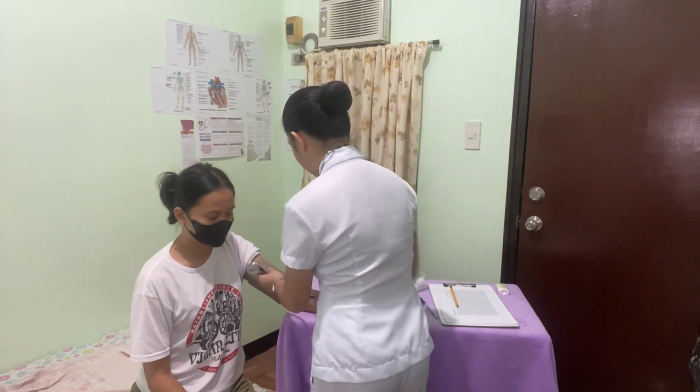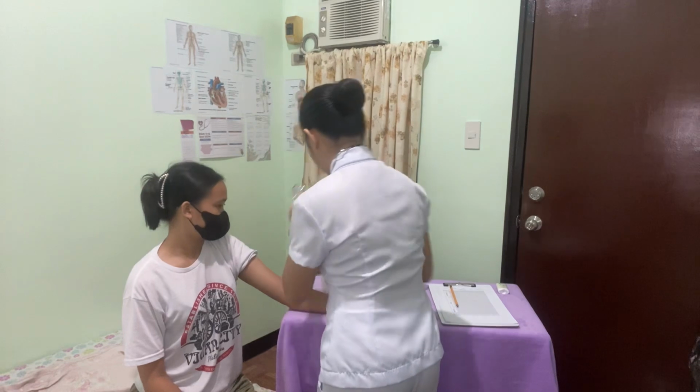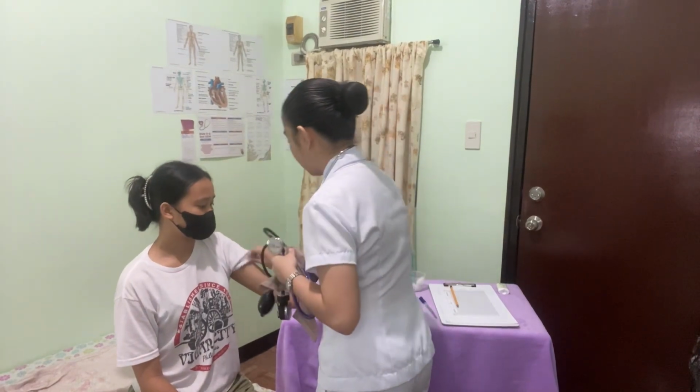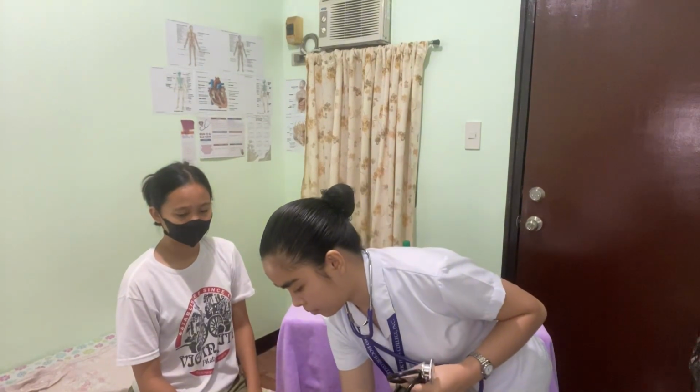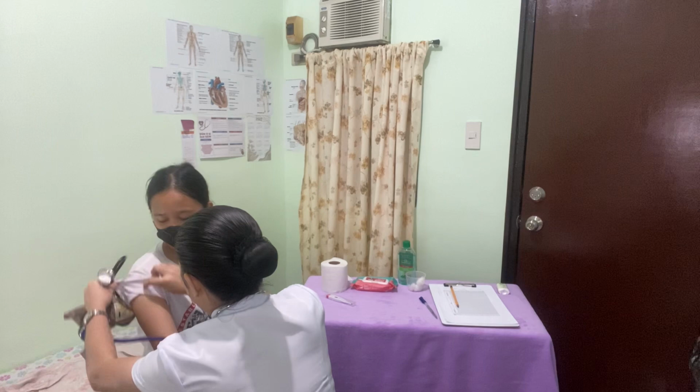And so, since this is my patient's initial examination, I'm gonna need to do the procedure again on her other arm. Can I pull up your sleeve now?